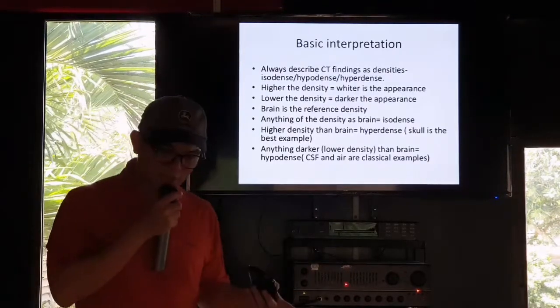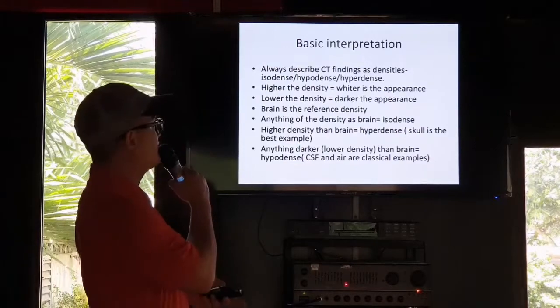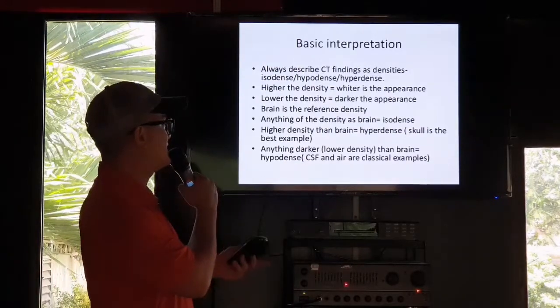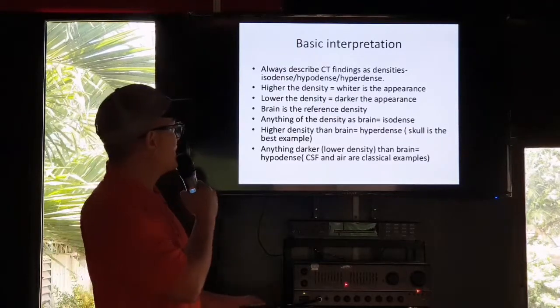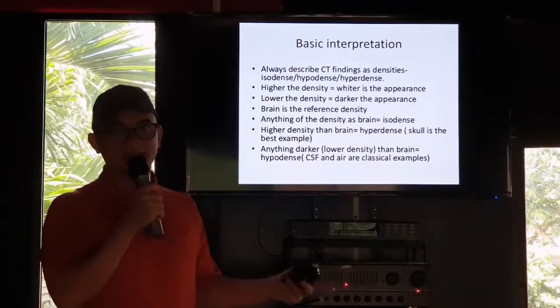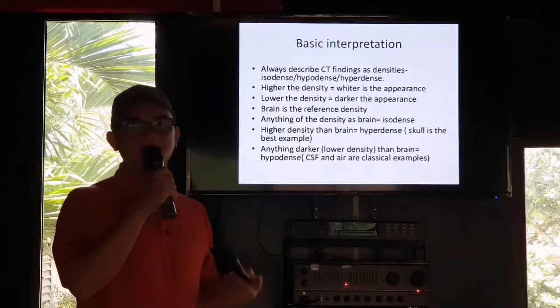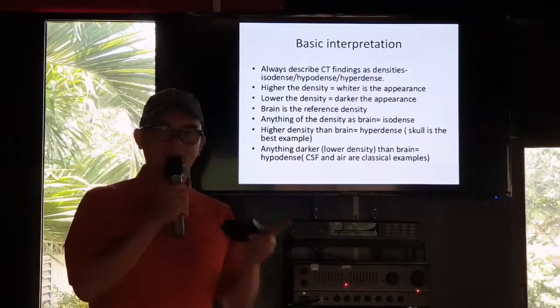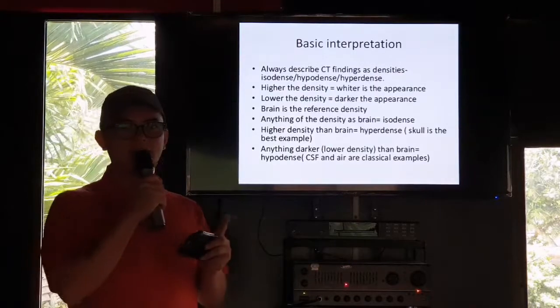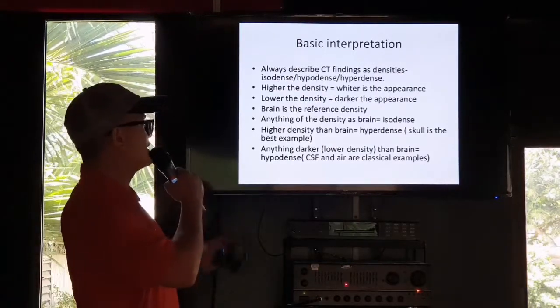Basic interpretation, so always describe CT findings as densities. So it's either isodense, hypodense, or hyperdense. What is the reference density? Is it isodense, hypodense, or hyperdense? Okay, always the reference density is the brain. The brain is the reference density.